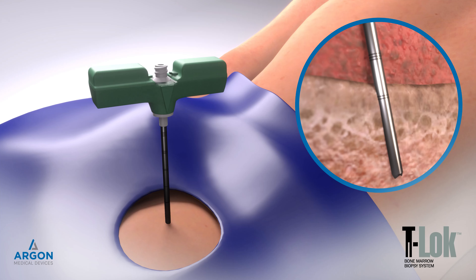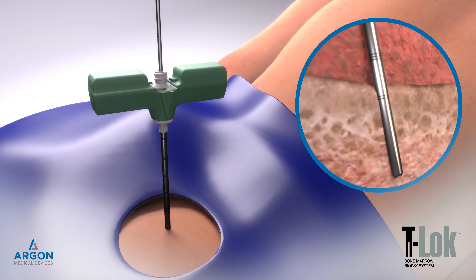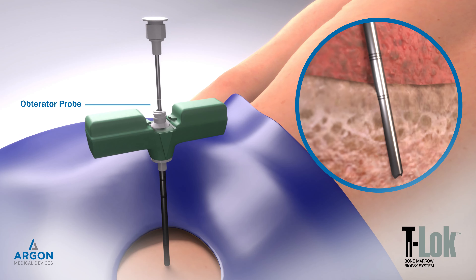Insert the marked obturator probe without force to check the sample length in the needle lumen. Sample length is indicated by referencing the position of the mark to the cannula hub. Remove the probe.